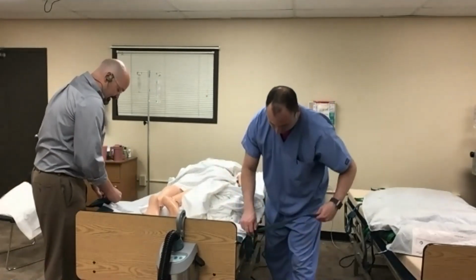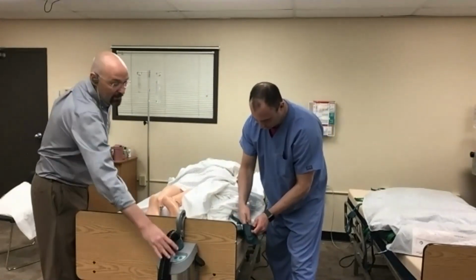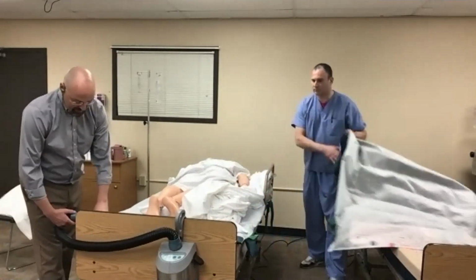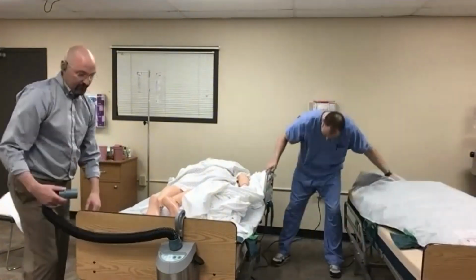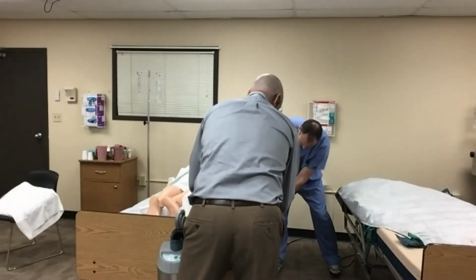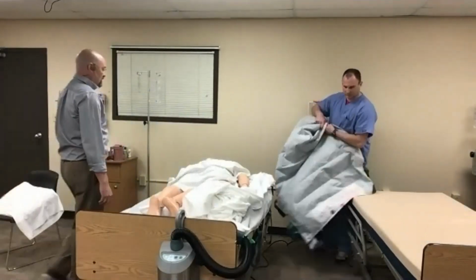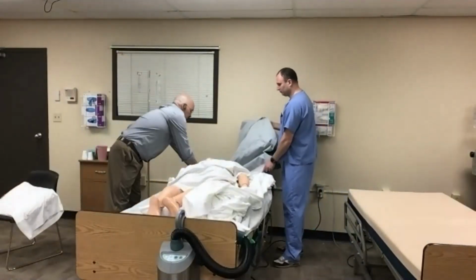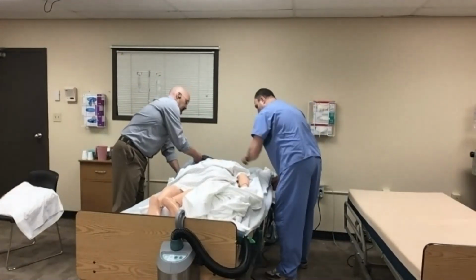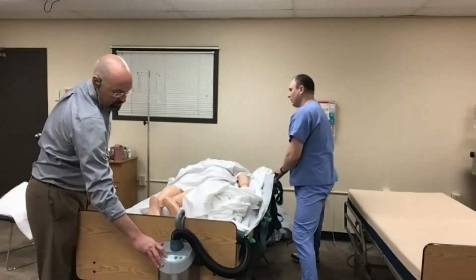Now you may think this is going to take longer than just manually grabbing him and going. It may take a minute or two longer, but it's significantly safer for your patient and significantly safer for your staff. The amount of force and stress it takes to do this is minimal, especially if I'm using that second surface. Again, as we do this, someone will be managing the person's airway here. So right now, we're going to reapply that HoverMatt underneath the surface.